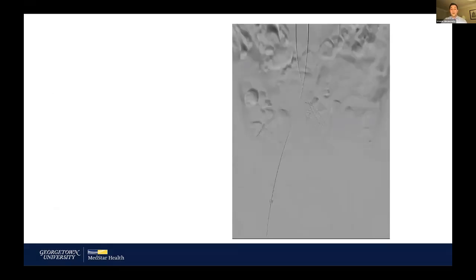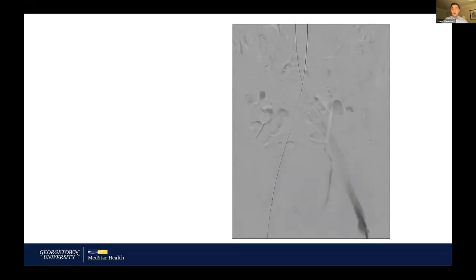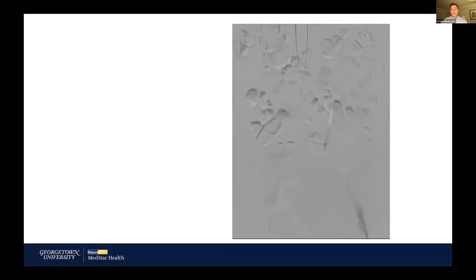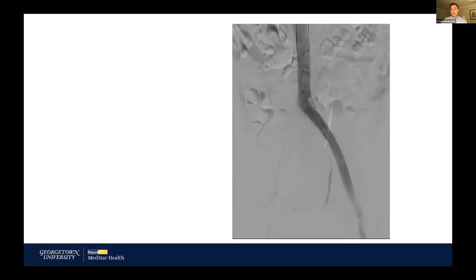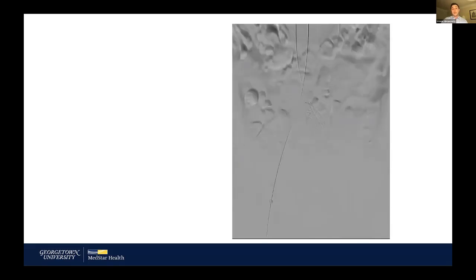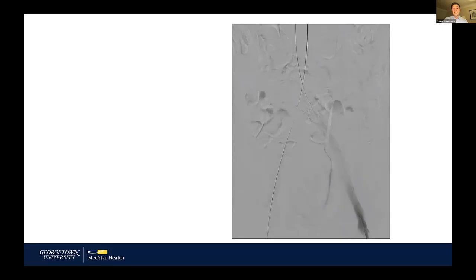We had essentially no visible rind or residual material left inside the stent itself and brisk emptying through the cava. All in all, the procedure including crossing took about 90 minutes, with about 30 of those minutes spent revving. The procedure was definitely able to restore flow in a stent that had been occluded for at least six years.